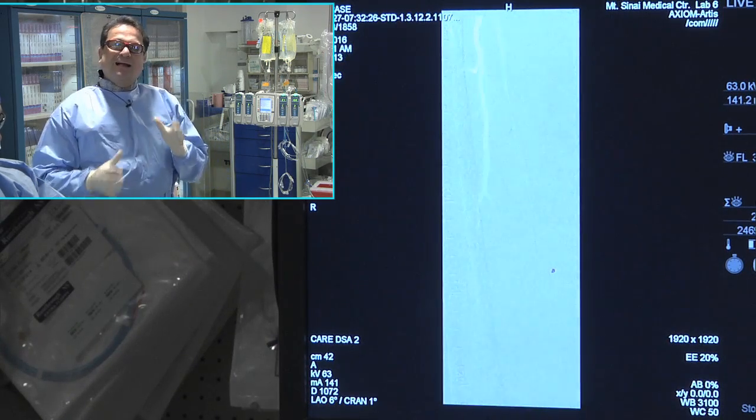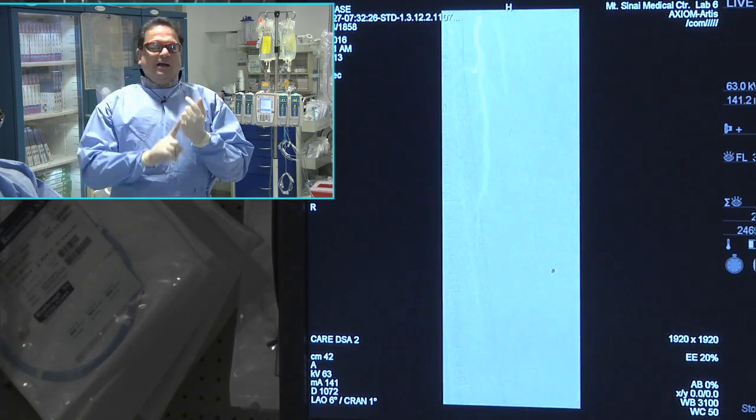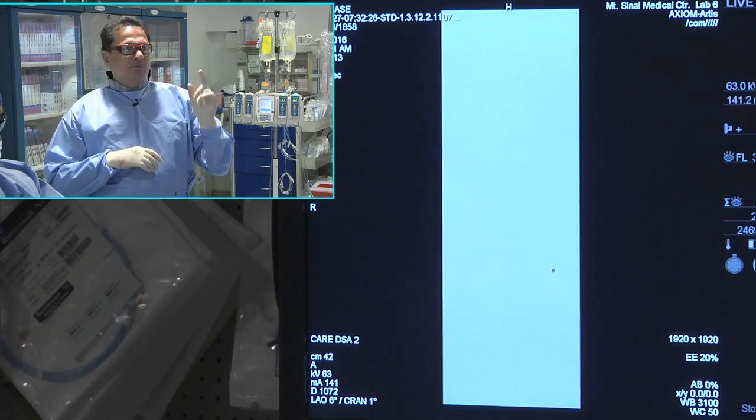So here I believe that atherectomy becomes an adjunct to our therapy. So I think that atherectomy has to work here for whatever reason, either a high plaque burden, or you have a heavy calcium that you feel is non-expandable, or whatever your preference may be for you to use it.